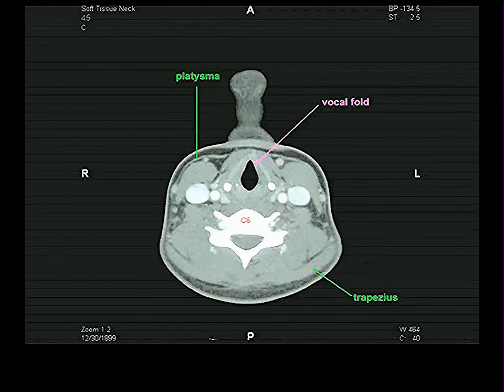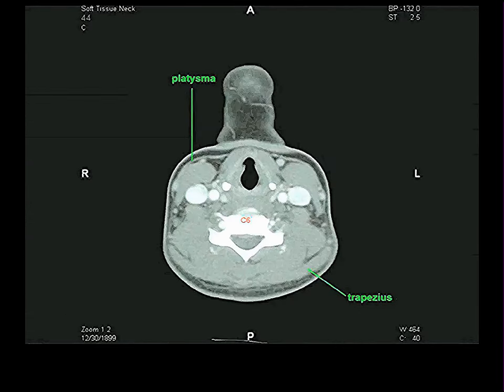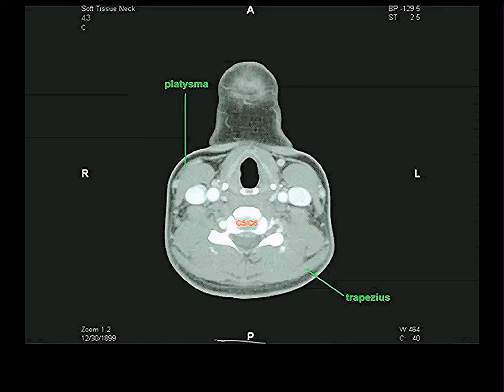Keep on going up. Here are the vocal folds. There's a little calcified dot there, which might be in her arytenoid of that side. When you see that V there, that's always vocal folds. But nothing else has changed. You still have a common carotid. You have an internal jugular lateral to it and in contact with the sternocleidomastoid. Going up, up. We are now in the supraglottic portion of the larynx.